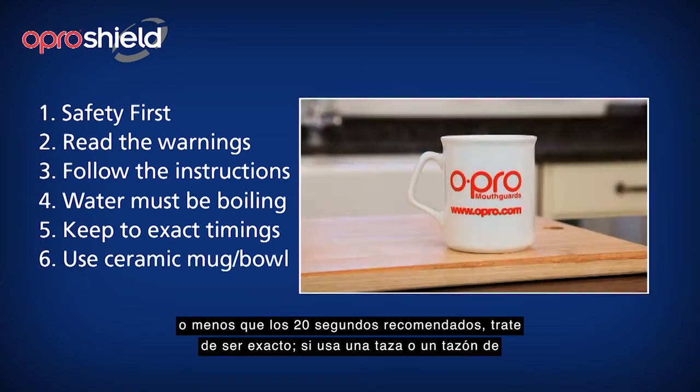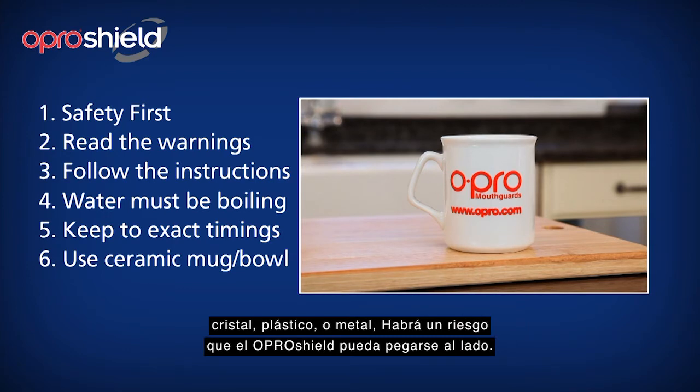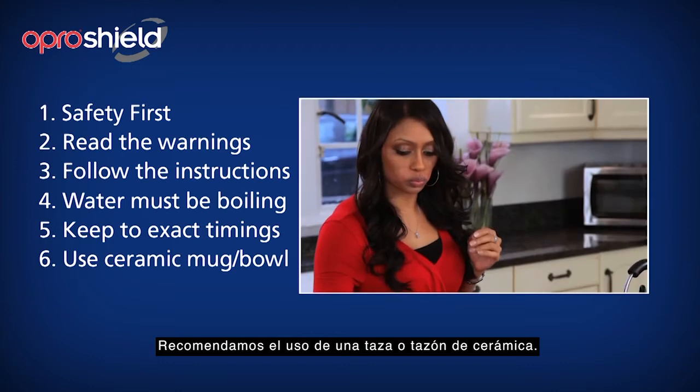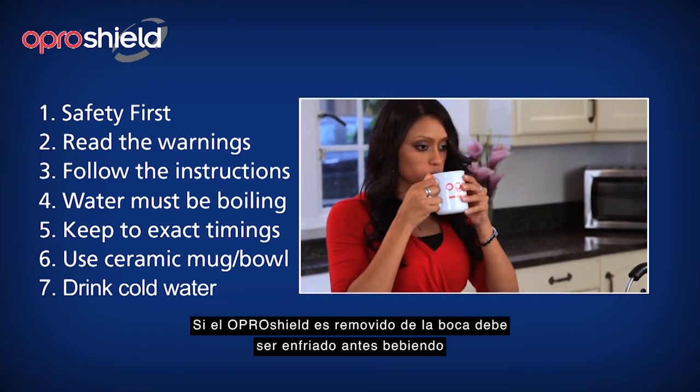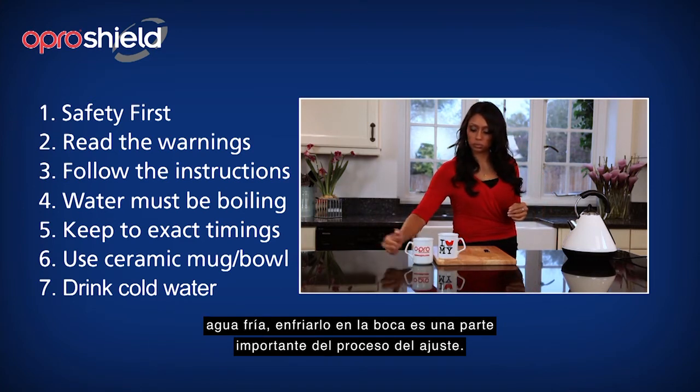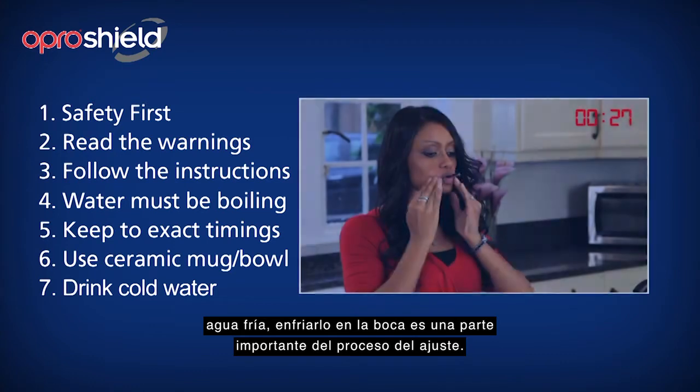If you use a cup or bowl made from glass, plastic or metal, there is a risk that the OproShield may stick to the side. We recommend the use of a ceramic cup or bowl. If after fitting the OproShield is removed from the mouth before cooling with a drink of cold water, cooling in the mouth is an important part of the fitting process.